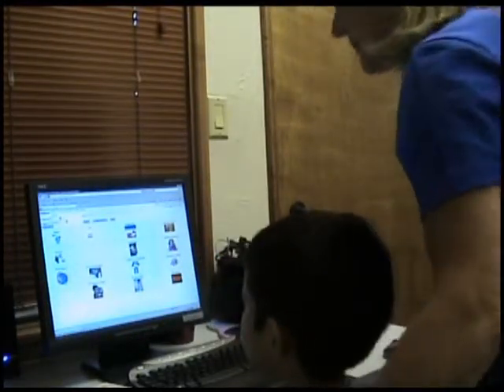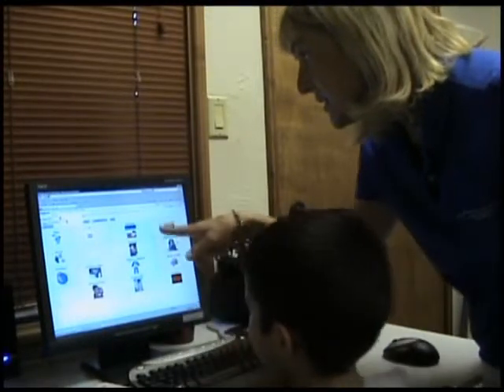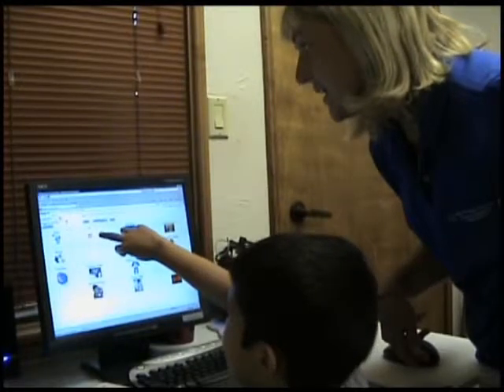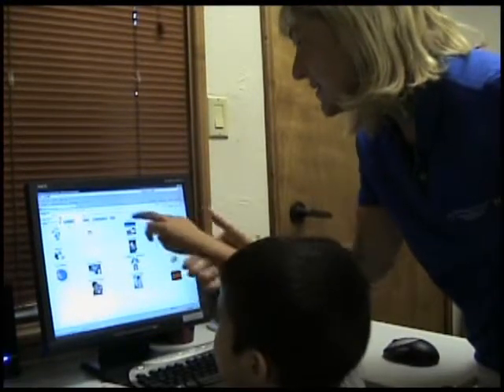Is. Can you find is? Can you find is? Is. Is. Push it hard. Is.